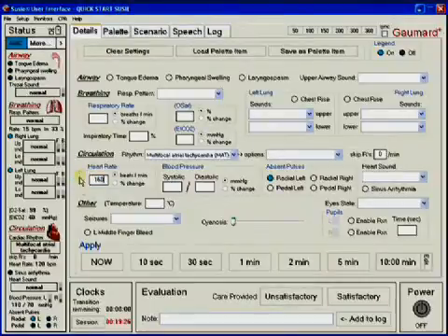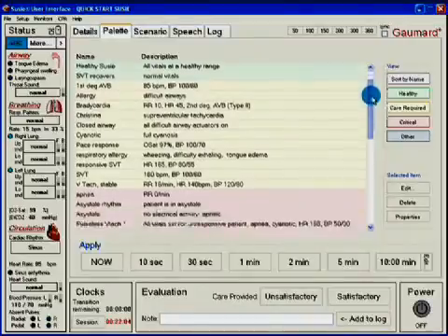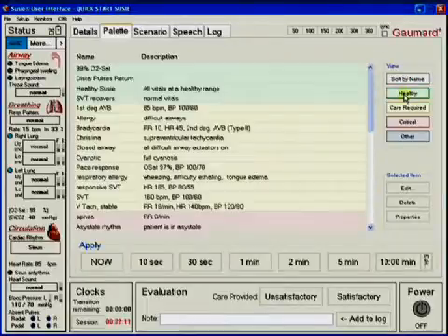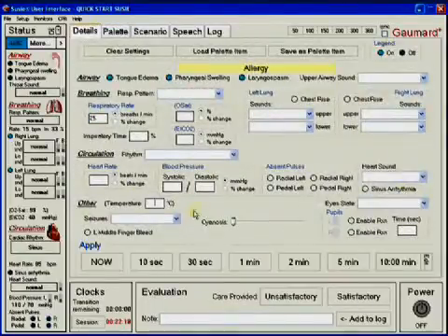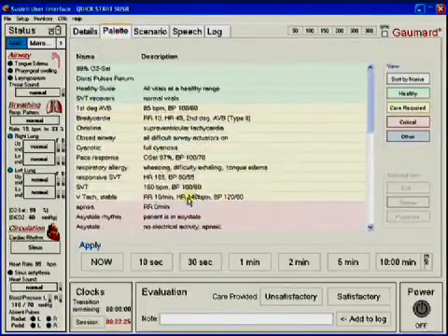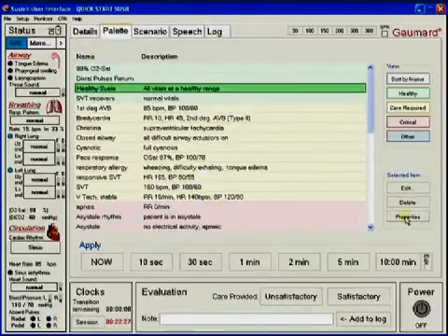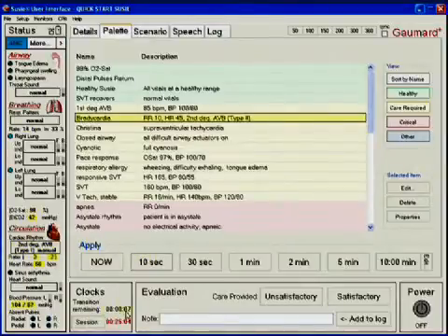Parameters can be applied to take immediate effect or trended to change over a set time period. Palette items that have been saved from the details tab are displayed in the palette tab. For visual clarity, palette items appear in four different colors depending on the desired condition of the patient. Palette items can be altered at any time by clicking Edit, which takes the user back to the Details tab. They can also be deleted permanently or checked for properties with a simple touch of the stylus.